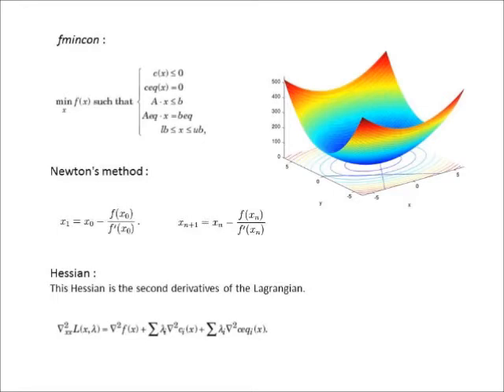This method is more computationally exhaustive, but it is evidently more accurate in our experiments. The solver may stop when it reaches a limit on the number of iterations or function evaluations before it minimizes the objective to the requested tolerance. The iterative display may help in interpreting the results.